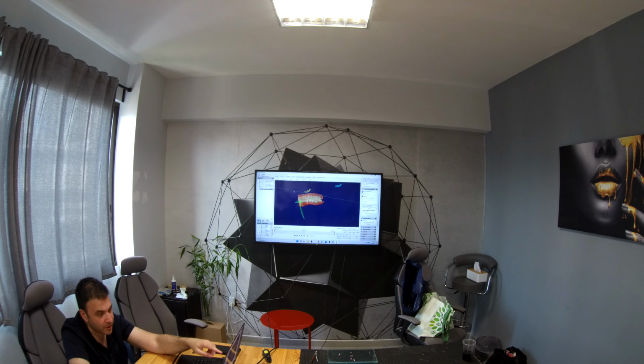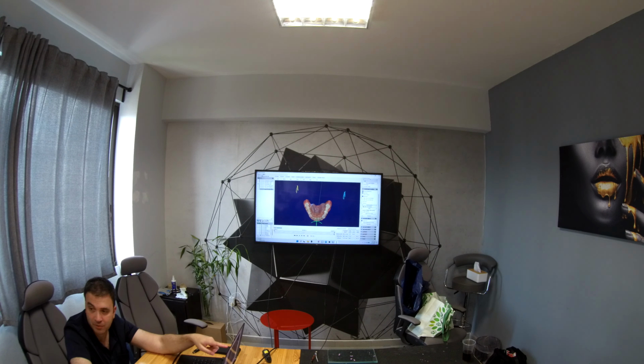that said that she has, if you look here already, you can see this in the mouth, this position. But when she was biting on articulating paper, she was biting because she had something between her teeth. And she was more careful. That's why we see the contacts on the right side, we don't see contacts on the left side. And that actually is her complaint, that she doesn't feel enough support on the left side.